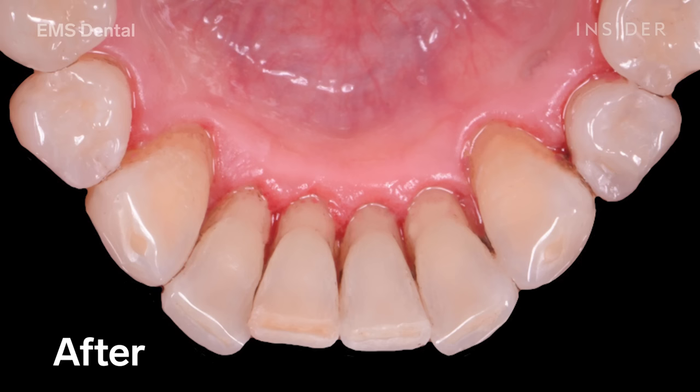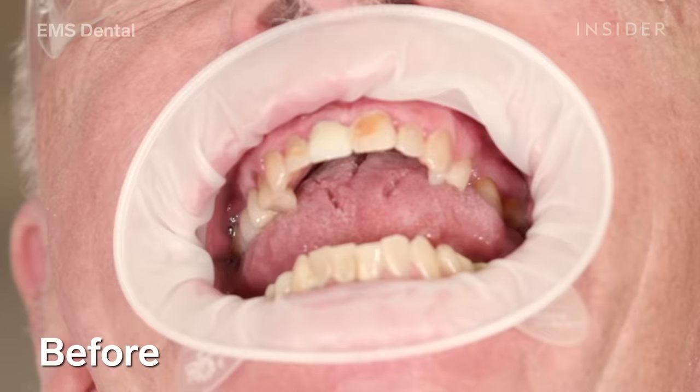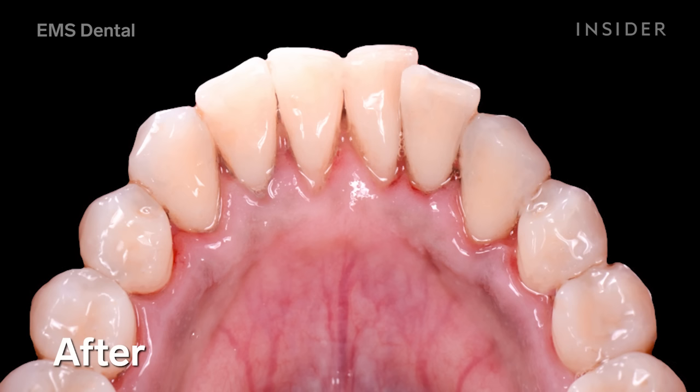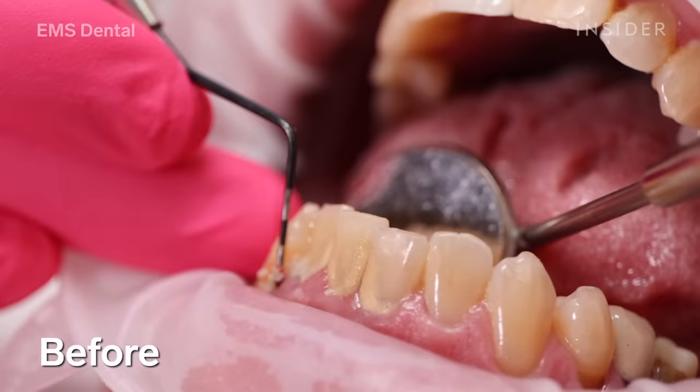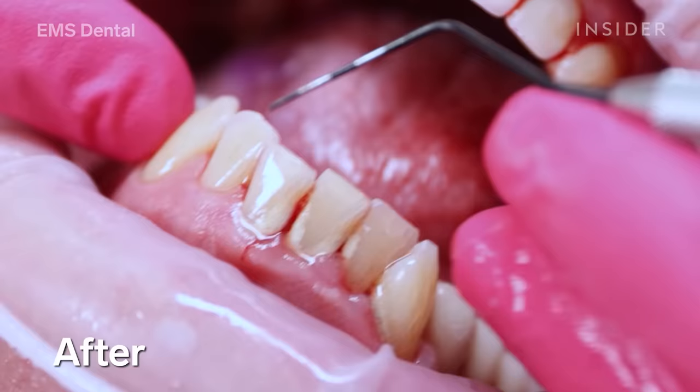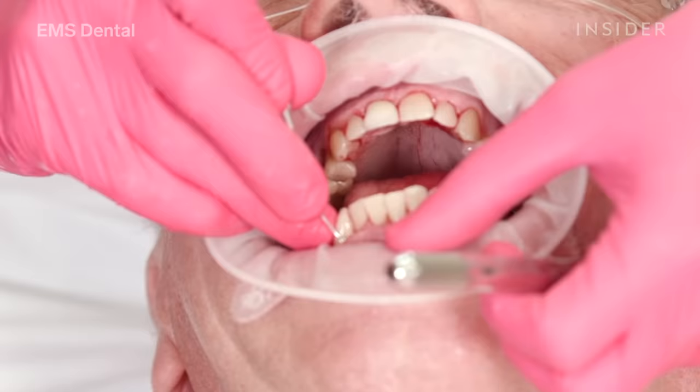Stage seven of the GBT process is our quality control stage. I spend a few moments checking around the whole mouth to ensure all the deposits have been removed and all the biofilm has been disrupted. I then hand the mirror back to my patient so they can see the before-and-after results of their guided biofilm therapy treatment, and I ask them to run their tongue over the teeth to feel how silky smooth they are now that the biofilm and calculus has gone.